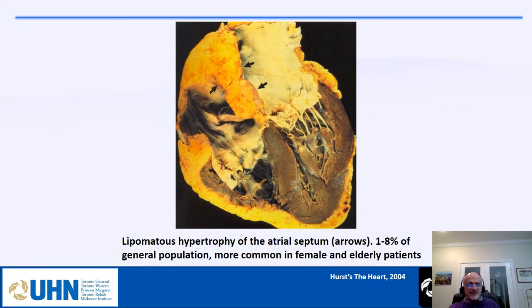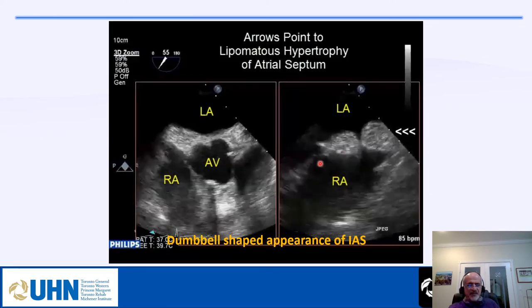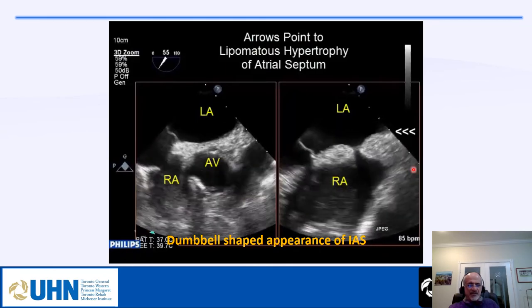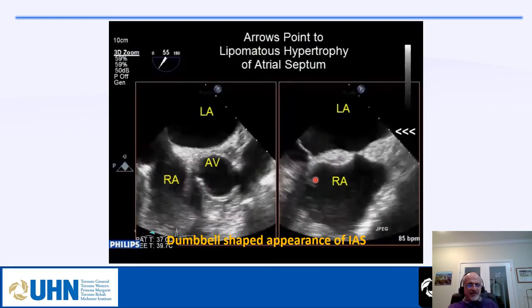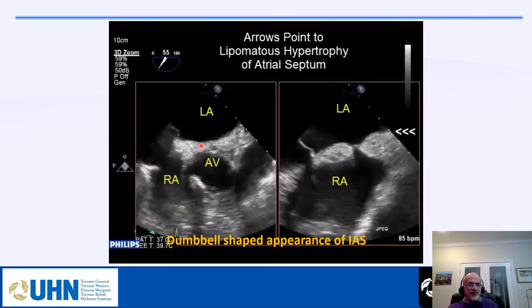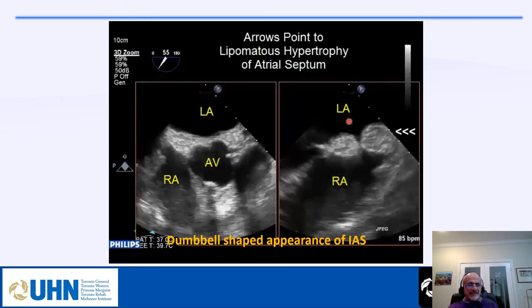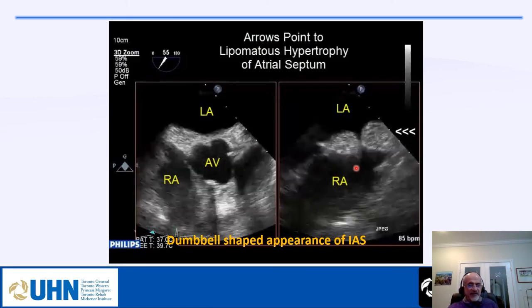Another challenge is lipomatous hypertrophy of the interatrial septum. On x-plane you can see the dumbbell-shaped appearance, with the fossa ovalis spared. This creates a challenge during septal puncture, as the catheter may go into the fatty part. Using only one view is insufficient — we should always use x-plane to see the perpendicular image confirming the catheter is not outside the heart. The second x-plane image is perpendicular to the first and is right-left reversed, so we must be careful.